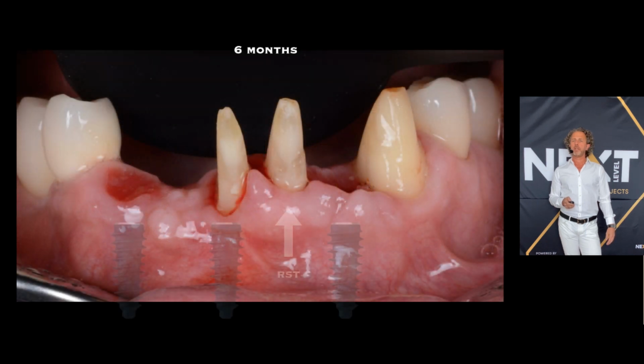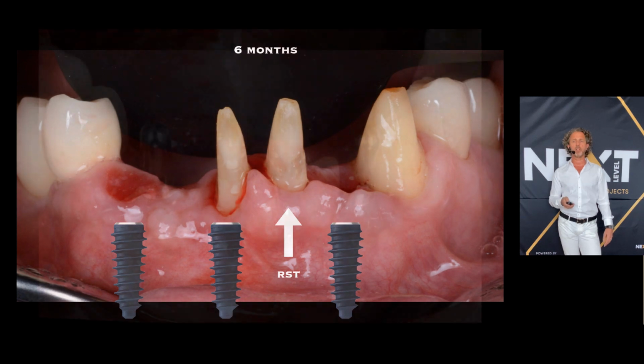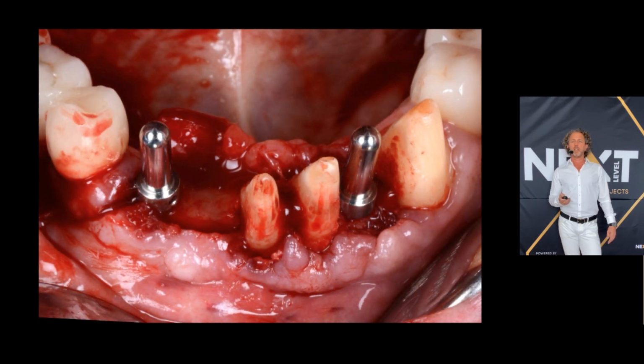So my plan should be placing 3 implants, 2 on both sides to the GBR. But the third one should be an immediate implant placement. But as I didn't see any periapical lesion or problem with the second root, I decided to leave it, cut back to bone level, and let it covered by the soft tissue, and this is what we call root submerge technique. So here's the image of the operation.